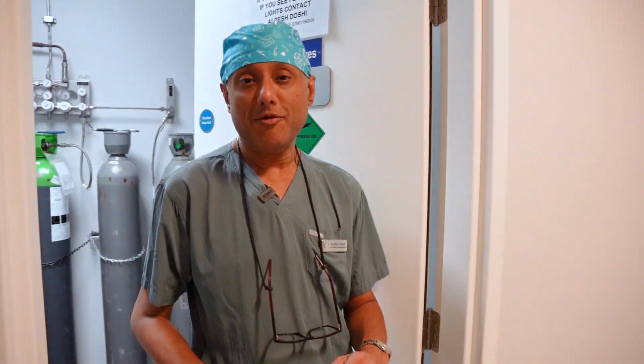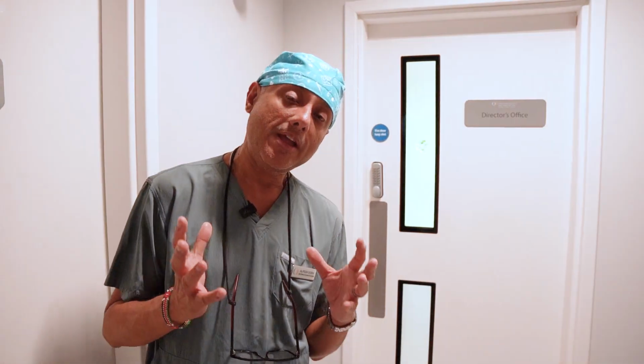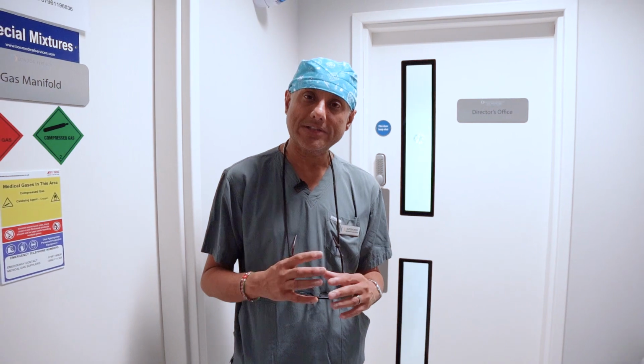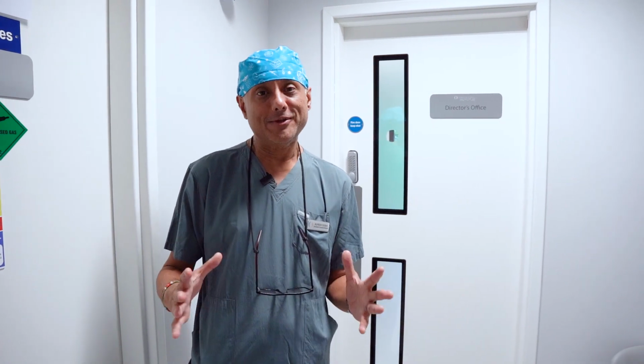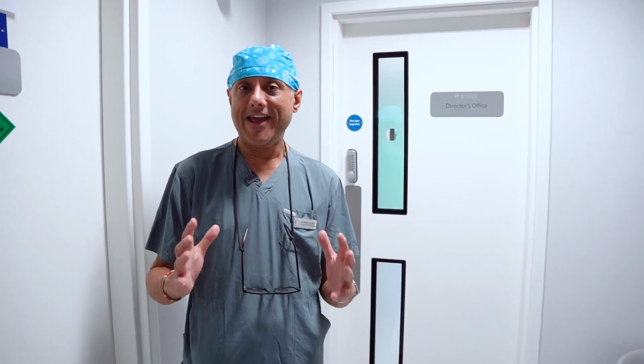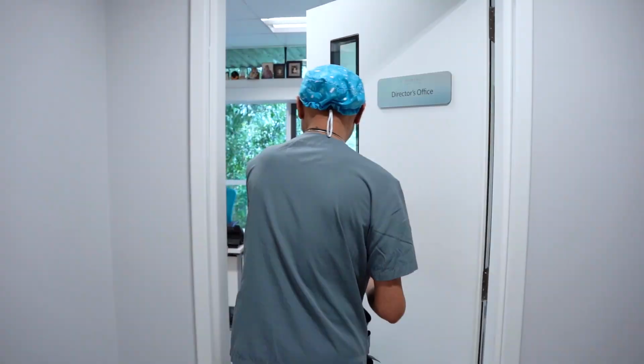Now, the other thing I wanted to add is we have some very sophisticated equipment in the laboratory which safeguards your eggs and embryos. We have a 24/7 alarm monitoring system, which is continuously taking temperature readings of the incubators as well as the dewars which have got your saved or frozen eggs or embryos. And I'm going to show you this room now, which is what we call the vault, where your eggs and embryos are stored in liquid nitrogen. So you can come through.